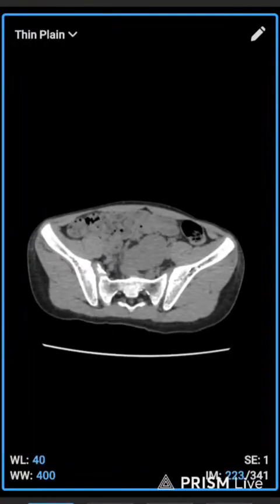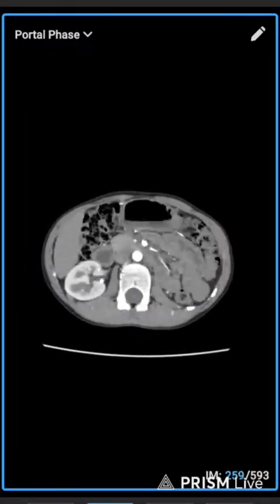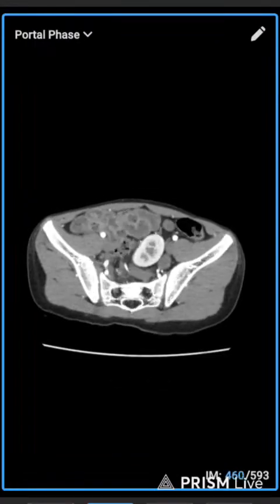Sometimes you find this type of patient; maybe it's not a problem, it's an abnormality.